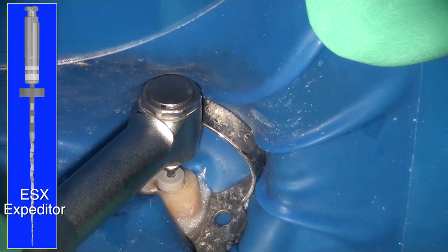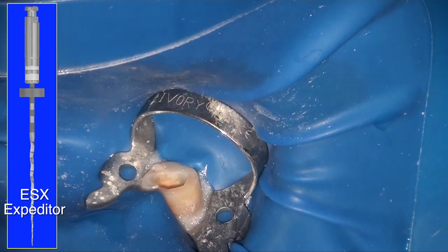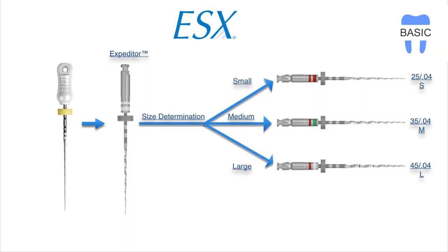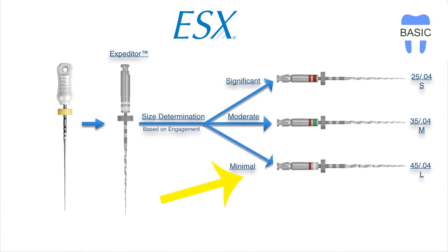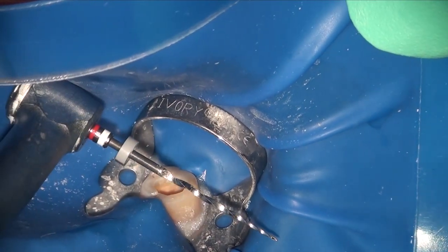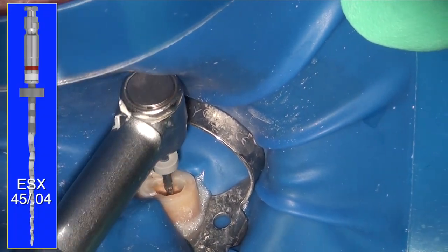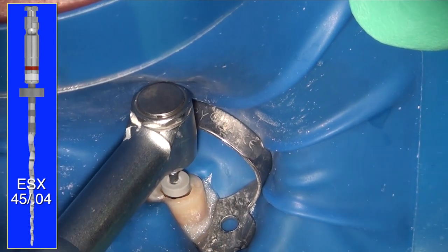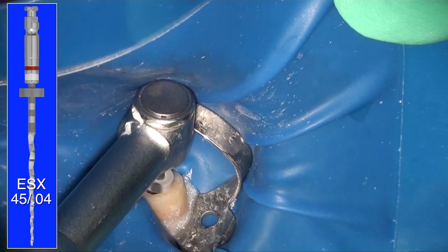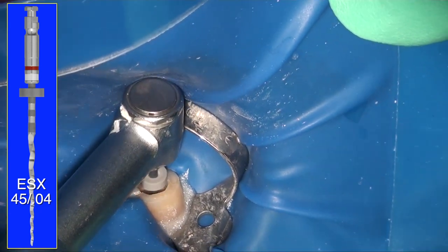I've put my ESX expediter to 22mm, and right off the bat with minimal resistance it goes all the way down to the full working length. From our protocol — if you recall our technique card — if you have minimal engagement of the expediter, you would use a size 45. So we go straight to a size 45 from the 15.05 expediter. You can see that the 45, right off the bat with the BT tip, goes down to the end of the root at the full working length.